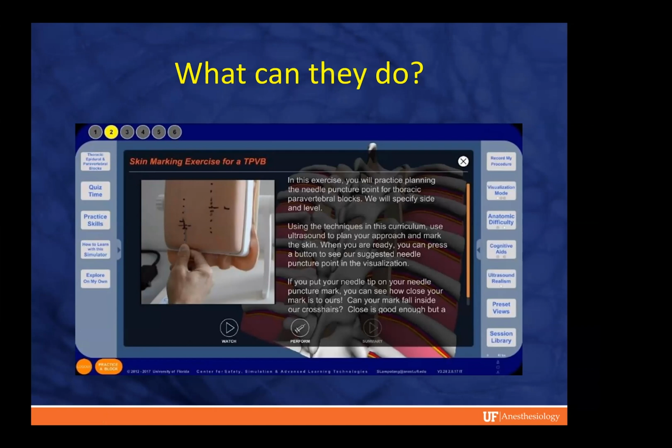The simulator itself will walk you through what you should do, and it'll tell you when you get it right and when you don't. So this can be used in relatively austere environments to teach people. You need a modicum of understanding. You need at least to understand what it is you're interacting with. But this can teach people who are not experts how to do things that at the concept level are kind of complex.